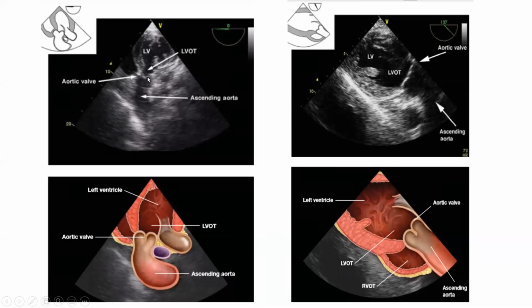I will get this 5-chamber view again, like the one you get in the transthoracic. This is the aorta here. This is the RVOT here. This is the LV here. This is the LVOT. This is the best view to get the gradient in the aortic valve. If you have aortic stenosis, this is the best view to get the gradient. You can get it also from 120, 130. You get the same long axis view, but it is not aligned to the beam of the ultrasound.